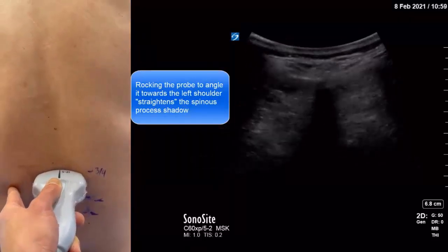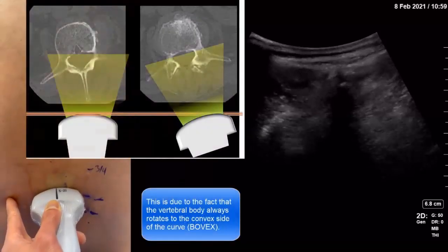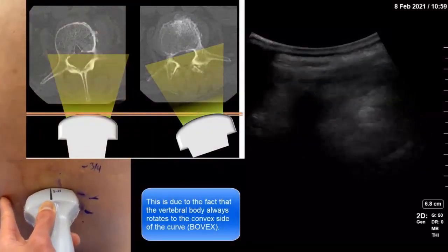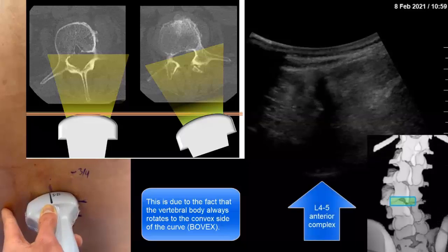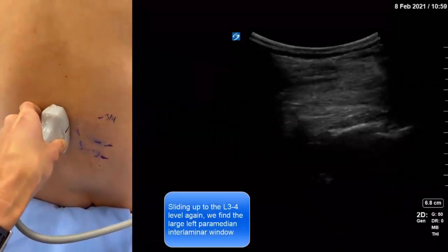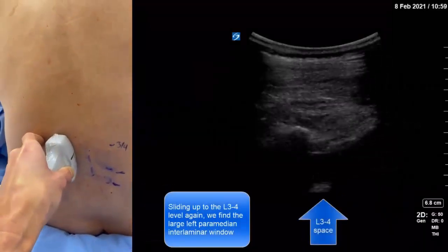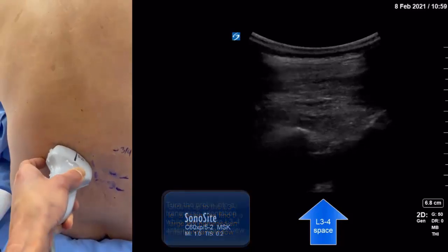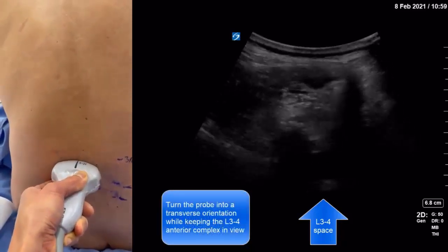Rocking the probe to point it towards the left shoulder will return the shadow to the vertical. This is in accordance with the Bovex rule: the vertebral body always rotates towards the convex side of the curve. In this case, you can actually see the L4-5 space through the midline as evidenced by the anterior complex. However, it is a narrow window. It would be better to target the large paramedian interlaminar window that we identified at L3-4 on the left convex side of the curve.